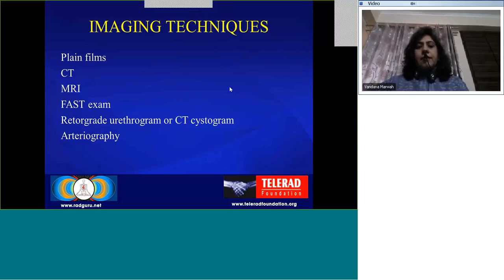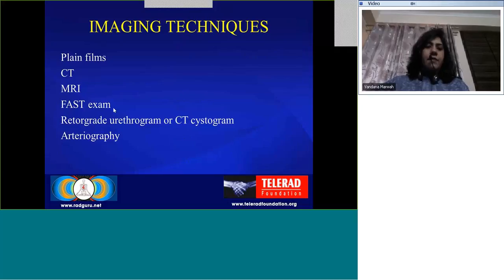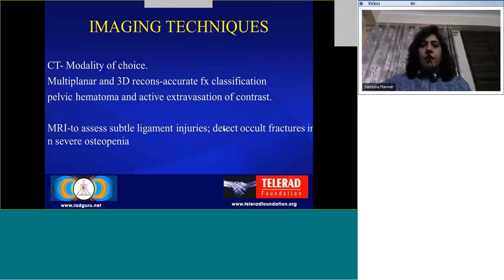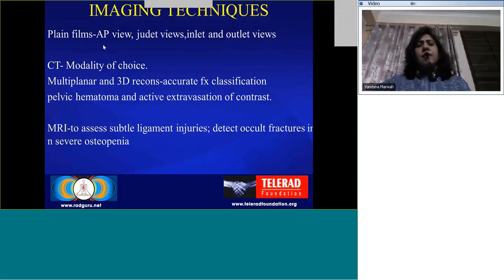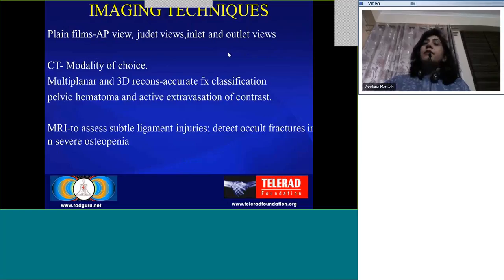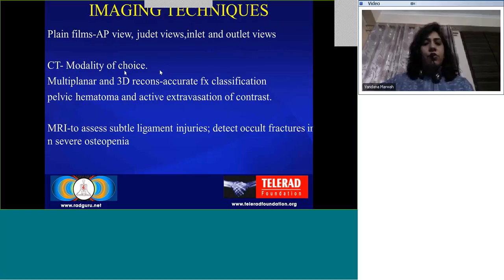Imaging techniques: the various imaging modalities include plain films, CT, MRI, FAST exam, retrograde urogram, CT cystogram, and arteriography. Plain films in today's scenario have a somewhat limited role, but in certain situations plain X-rays are done immediately. These are some of the views which are done, but in pelvic fractures the patient may have unstable fractures and it may not be possible to do all the views. CT, of course, is nowadays the modality of choice.